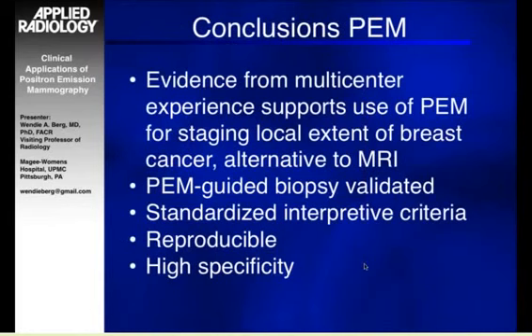So in conclusion, we now have evidence from a multi-center prospective clinical trial that supports the use of PEM for local staging of breast cancer. It's an alternative to MRI, especially for women who are unable to tolerate an MRI. I think importantly, PEM-guided biopsy is a very elegant and now validated technology and may even be better than MRI. We can talk more about that if you're interested. We have standardized interpretive criteria for PEM. It's been shown to be highly reproducible and with high specificity, so we're unlikely to cause problems for patients as a result of doing the PEM.